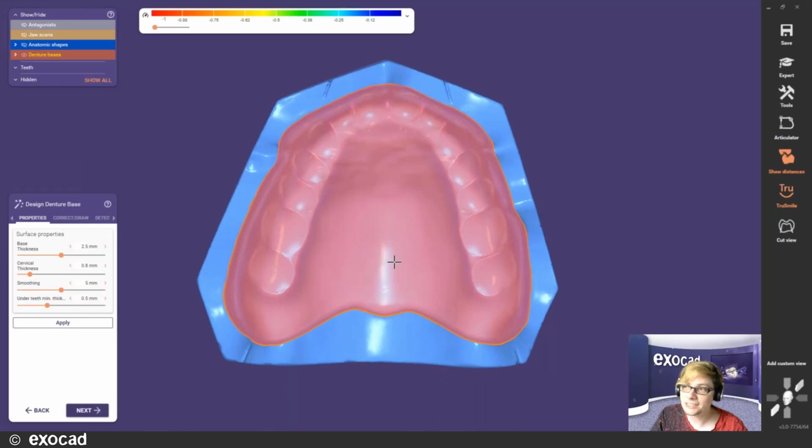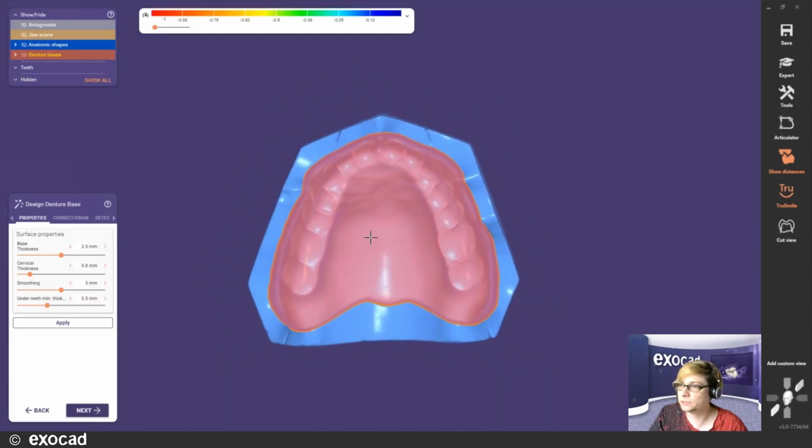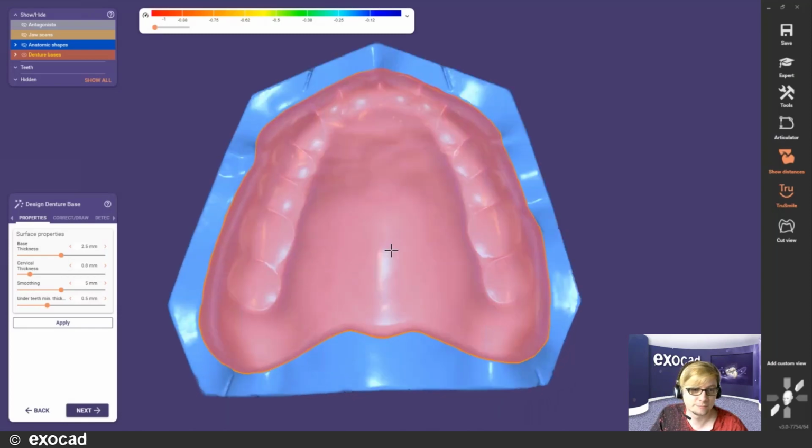It is not yet available for scalable teeth because instant anatomic morphing is also not available for virtual articulators and so on. But I presume it will be available for all kinds of teeth that can be reformed in the work process. Yes, I don't see a reason why we wouldn't make it available in the future.